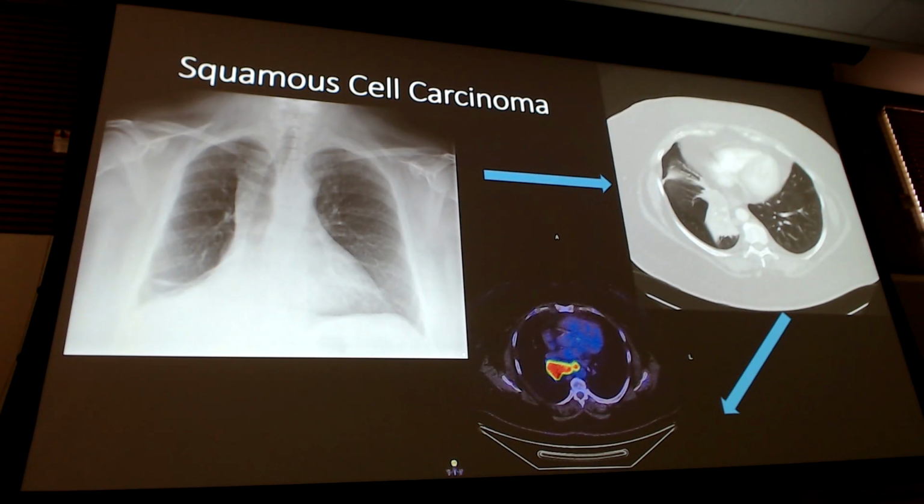Okay, we get a CT, right? Concerned. CT shows, look at the calcifications in the CT now in my mass. See all those little whiter, brighter dots inside that mass? Those are the calcifications of your malignant tumor. So what's going to happen in real life is basically got the x-ray, concerned, ordered the CT to help confirm that that's what's going on in there, because I can really get that fine detail. Look, I can even see the spiculated margins here on the CT, like it's all kind of funky and pointing out. All right, and I got the calcifications in there.